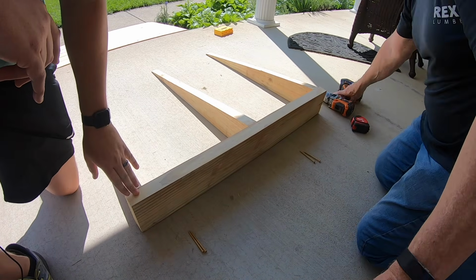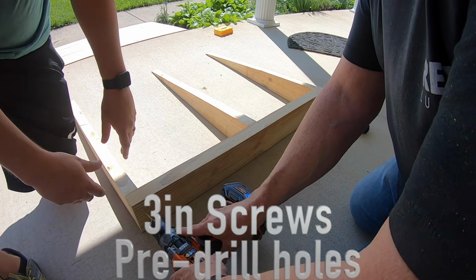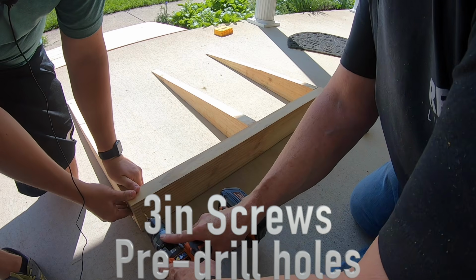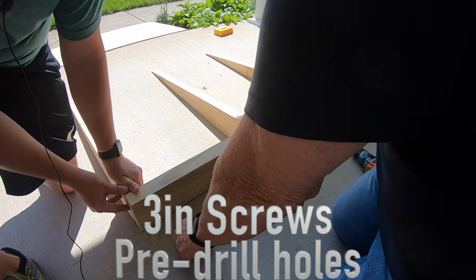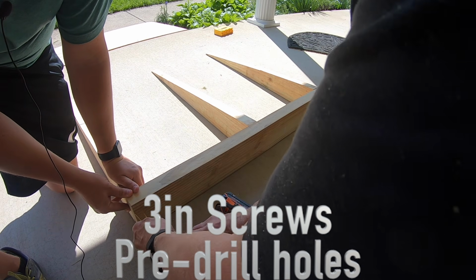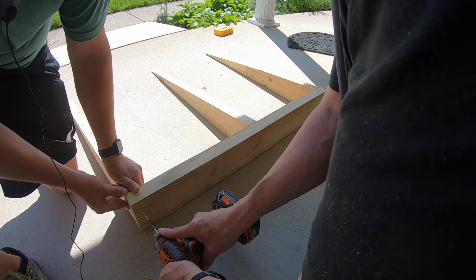So we're gonna start on the end closest and then just work our way down. And the big thing is you're gonna want to make sure it's nice and straight. And so pre-drill that in. When you're pre-drilling, make sure you do hit the center, not the end. And the reason we're pre-drilling actually is so we have the ability to not split the wood, which is really important. Go ahead and go.